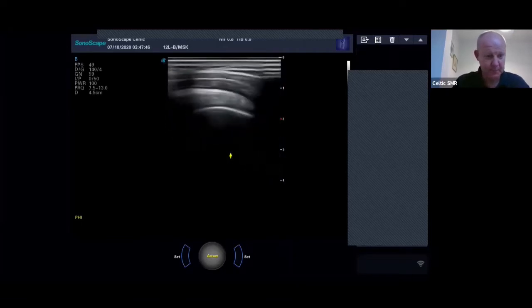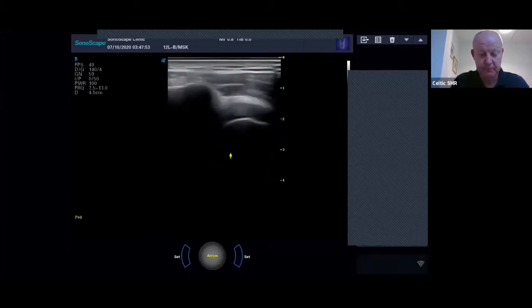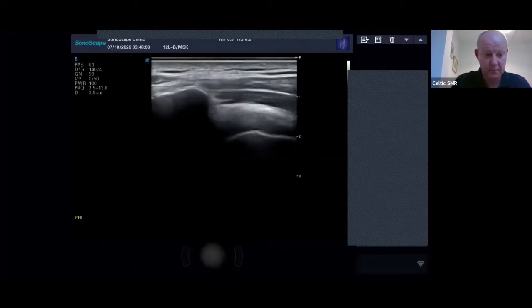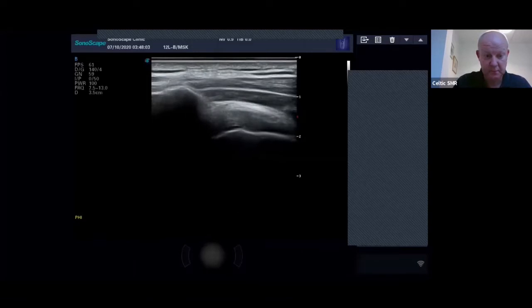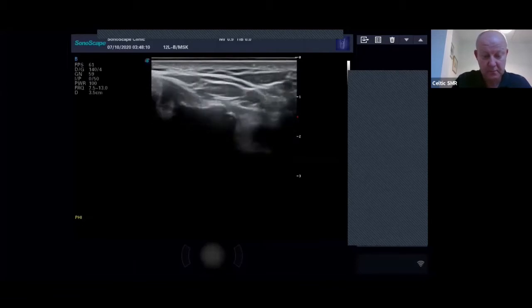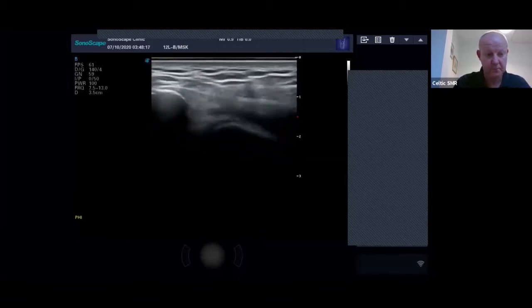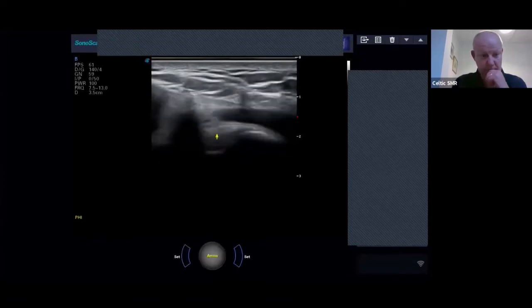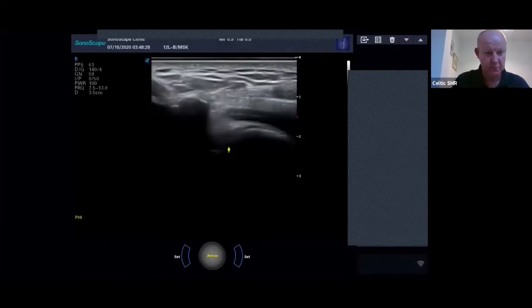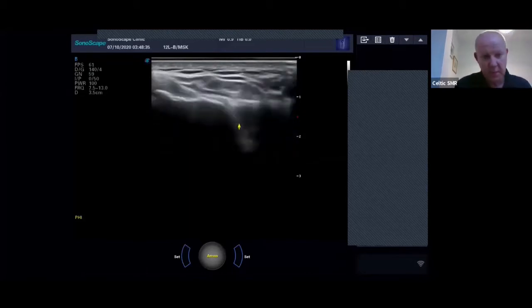Yeah. And then if you wanted to look for impingement, I'd come back to this area, try and pick up the acromion, and then that view here, and then abduct his arm. Yeah. So you can just see as it disappears underneath the acromion, that's a common site for impingement and fluid to pop up and bunch there. And just, so here, underneath the acromion here, you can see that coming out there and going back under. Nice.